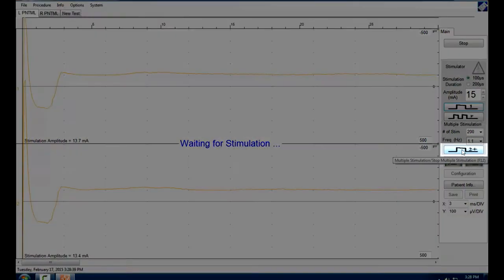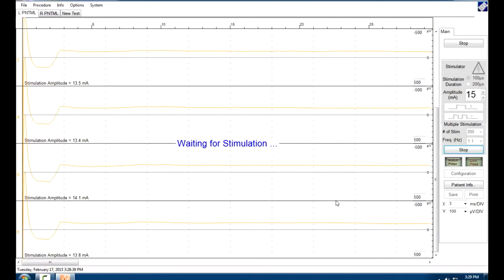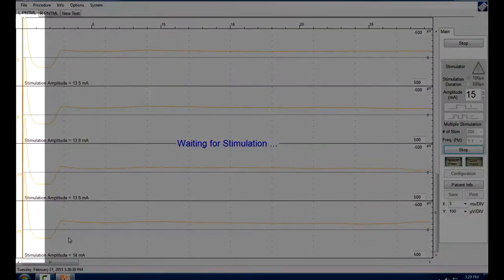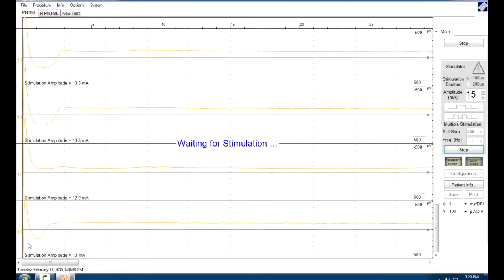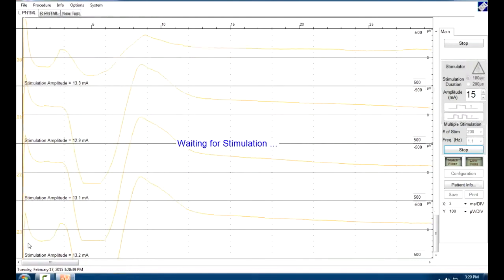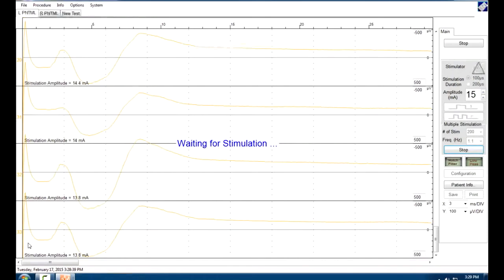So we're going to go to the multiple stimulation mode over here. This is going to give you one stimulation right after another. It gives you the one on the bottom and it moves it up. And you can see the numbers counting way over here on the far left-hand side. In this mode, you are able to then move the electrode until you find the location of the nerve. You can see how I'm moving it around on our subject here. We're getting different nerve impulse readings until you find the ones that you like.